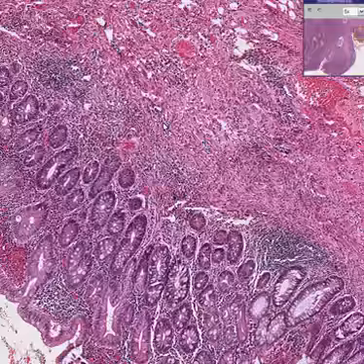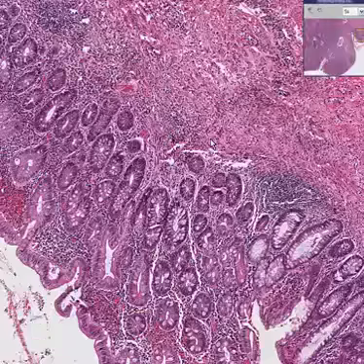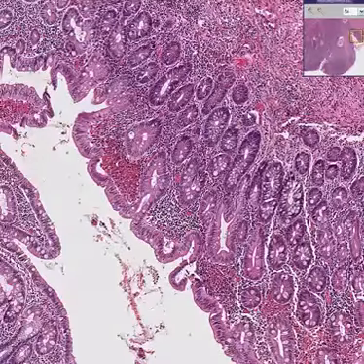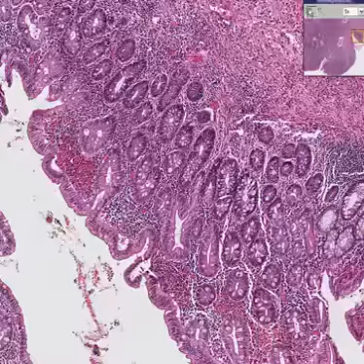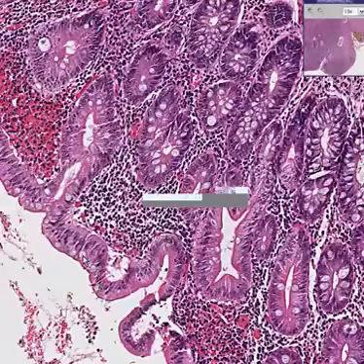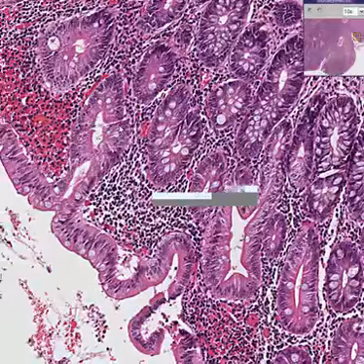Not only are they arranged sometimes in primary follicles or perhaps a secondary follicle, but they diffusely infiltrate the connective tissue and smooth muscle of the lamina propria, and also the lamina propria in other areas. Notice another thing about this particular colonic mucosa: it doesn't have as much uniformity in nuclear staining. Sure, there's a good admixture of goblet cells like here, here, here, here, which is nice, but the nuclei are not quite as uniform as they should be.